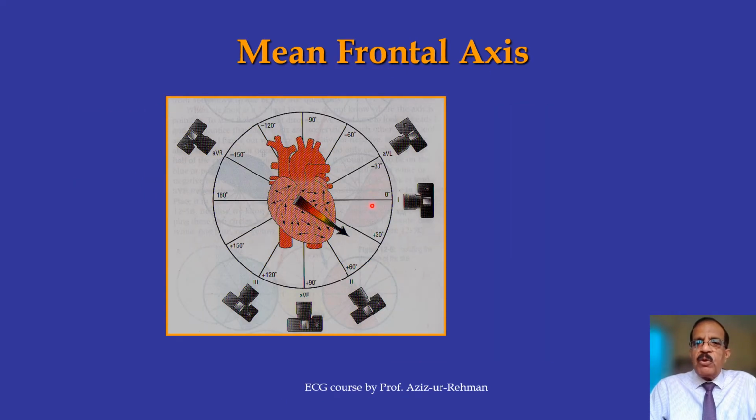Now we are coming back to the same picture. Now this is the picture. Every cardiologist, every physician actually has this picture printed in his mind, and that is required when we determine cardiac axis. Now, you can see 6 ECG leads. This angle is 0, 30 degree, 60, 90, 120, 150, 180, and then in minus. Now I'll show you how these angles are represented by various leads.